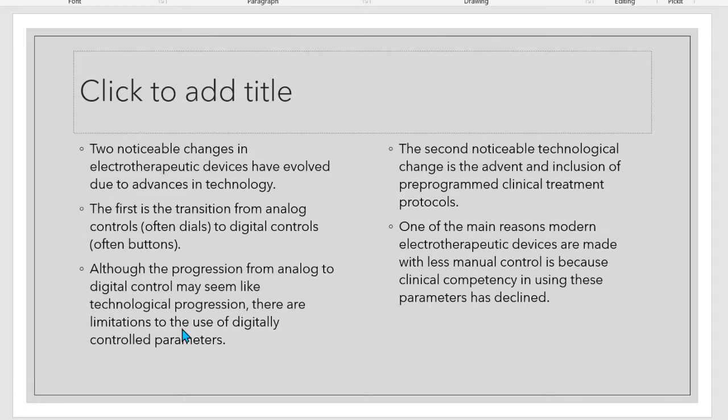He doesn't know how to apply the device on the patient, maybe because he lacks skill in assessment, or he lacks knowledge with regards to the case that he is handling.